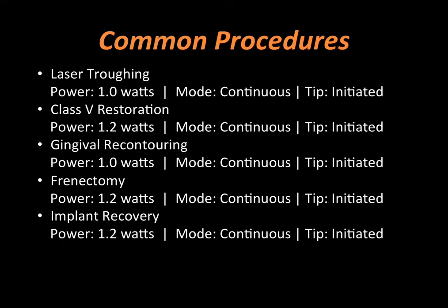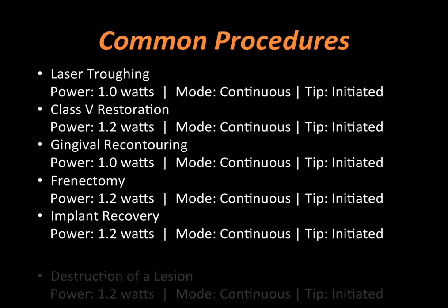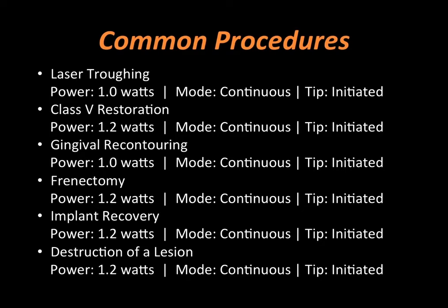Implant recovery, we know that if we bury an implant with a closure cap or cover screw, we have to excise the tissue over the top of those implants. And we normally would do that by anesthetizing the area, then taking a tissue punch, causing more bleeding and trauma before we take our impression. And now I use the diode laser to uncover the site with little or no bleeding afterwards. And again, aphthous and herpetic lesions are eliminated in a very, very short amount of time. We'll talk about initiated tips and continuous mode versus pulse wave mode.